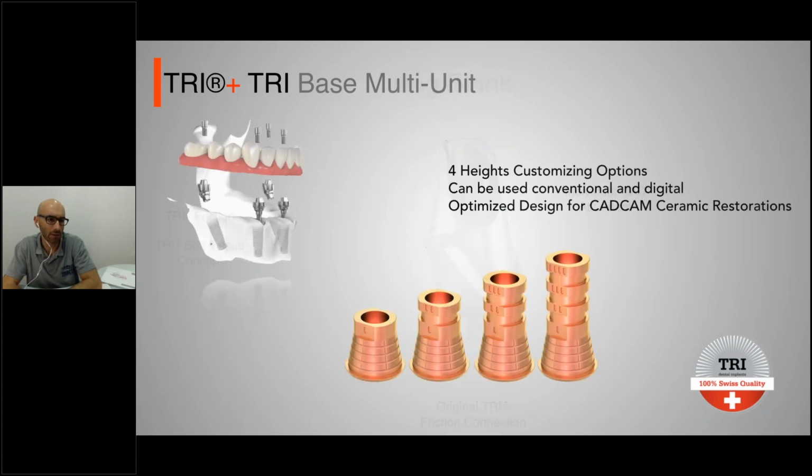Then in this digital family, we also have the multi-unit in case you have a full mouth restoration like a big bridge or full arch. Even here you have customizing options. You can choose also from the library. You can use it also in a conventional way, depending on your workflow. But they have an optimized design for CAD/CAM ceramic restoration. So you just have to glue this titanium base inside your restoration with very great results.